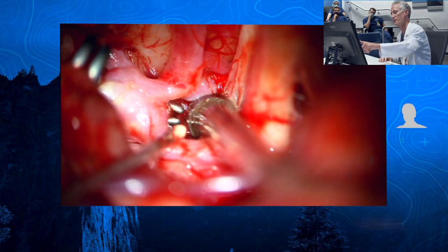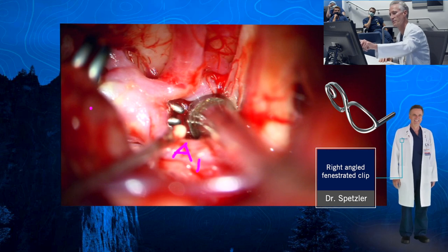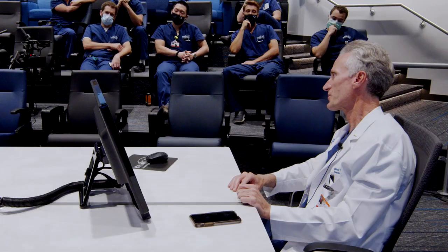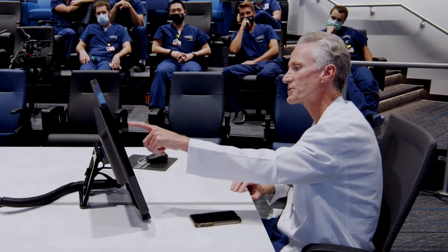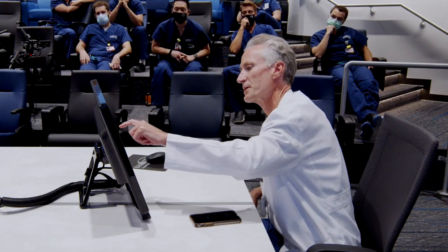About the fenestrated clip — remember, this is the A1, and the A2 comes off up here. If you fenestrate the A1 and try to get all the way down in that space, it's really hard, particularly when that cleavage plane on the opposite side is all the way up there. So it's not one that's fenestrate-able. I think you really needed a right-angle clip on that. This is interesting anatomy. Tyler, I'm going to give you three structures to identify.